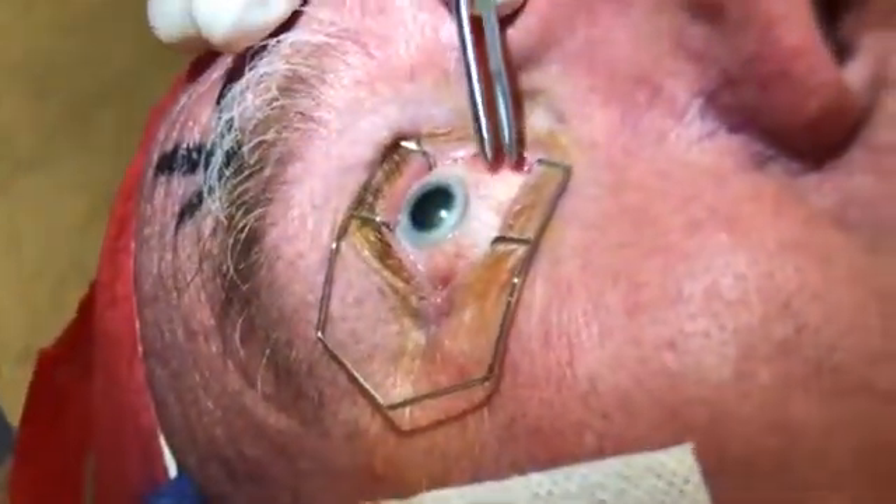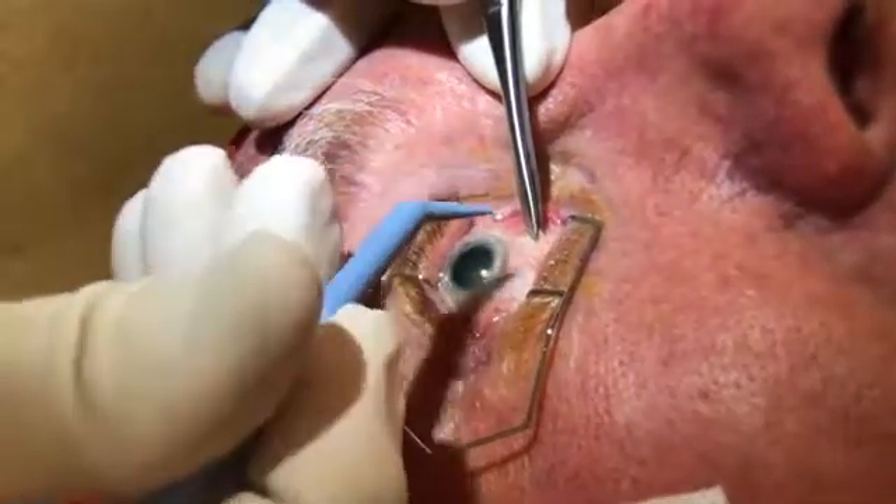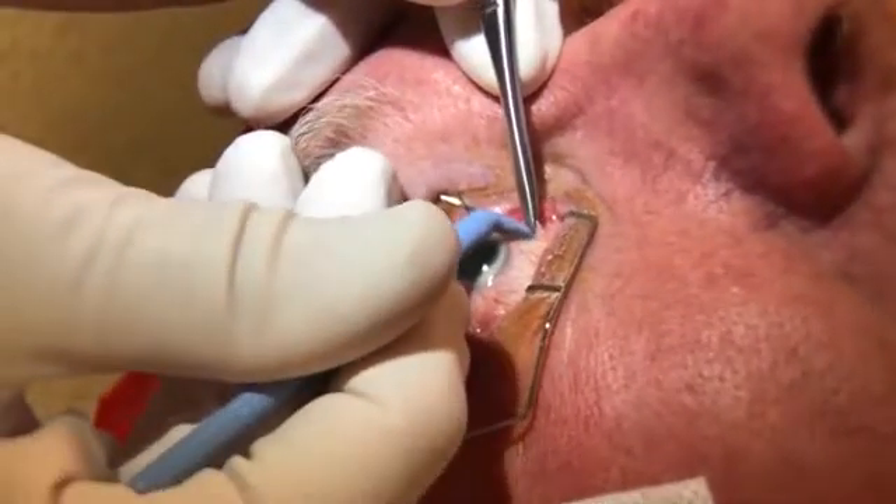I've got a fine pair of forceps here. I'm going to make a little nick on your conjunctiva. There we go — a little nick, that's just perfect, good.